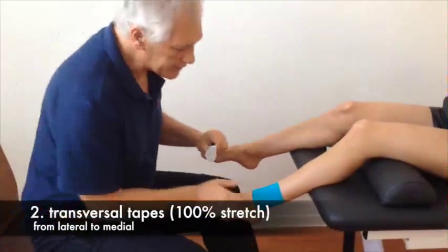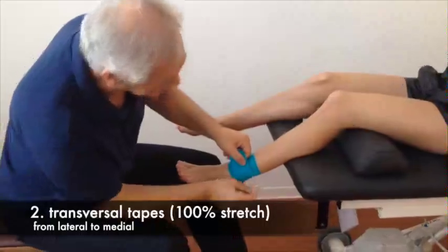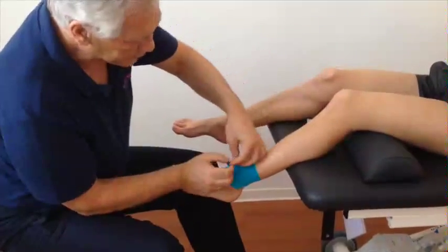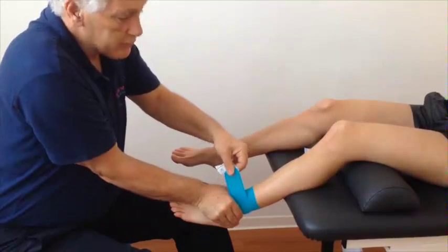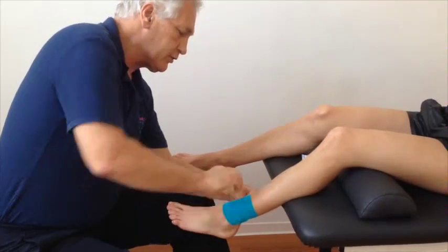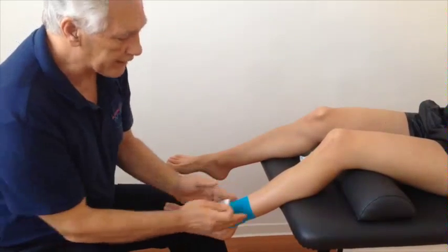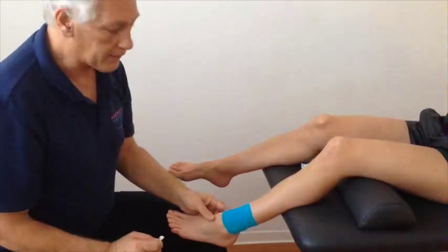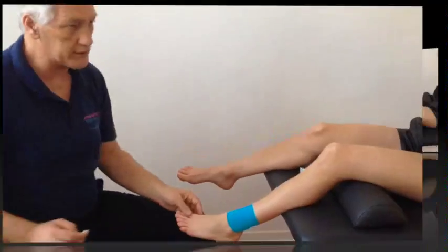The next step is applied with full stretch. You start at the backside of the fibula, squeeze the malleoli together again, then push and pull fully at 100% stretch to the backside of the tibia. This tape is pulled out maximally and is shortened by one-third of the measured length.